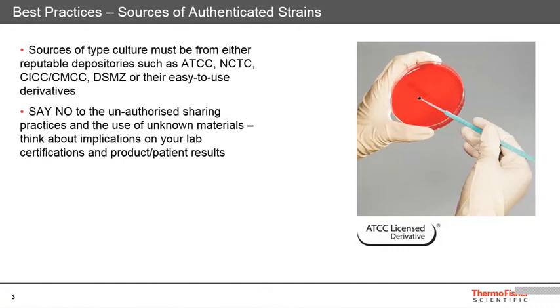However, what is not an authentic strain is a culture that you get from the laboratory of your friend at the other end of the town. Say no to such practices. There is too much at risk from using an unauthenticated strain. You're risking your patient samples because the quality control material that you just used is likely not to be correct. On top, sharing such strains with other organizations will most likely be prohibited if it is a known depository culture. Overall, this is not something that is worth losing your accreditation or reputation for.